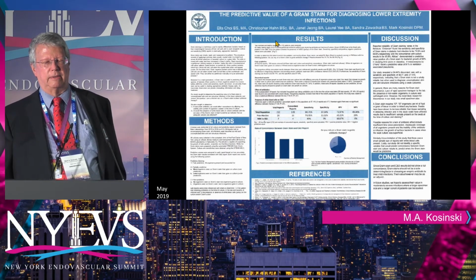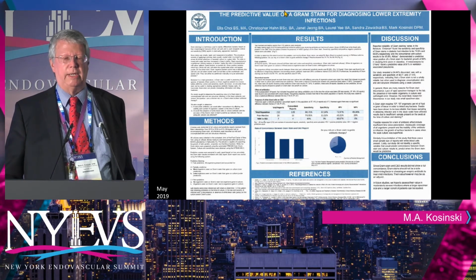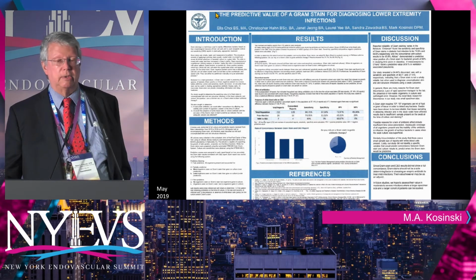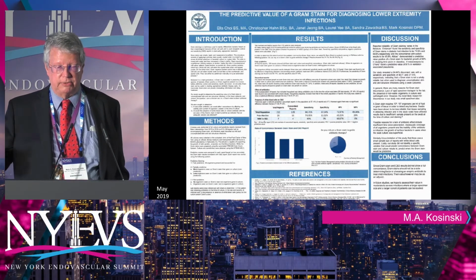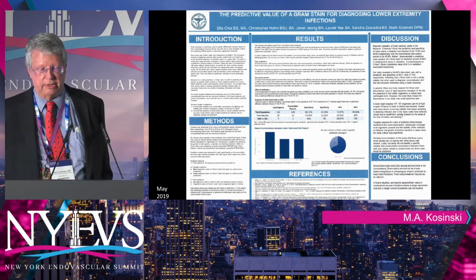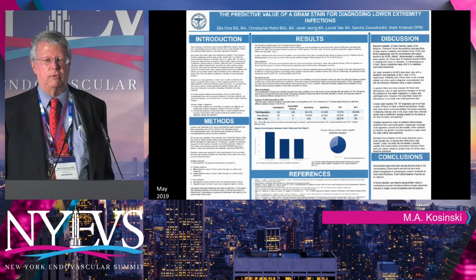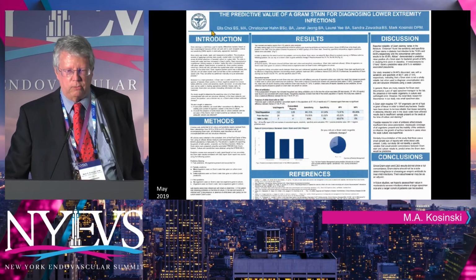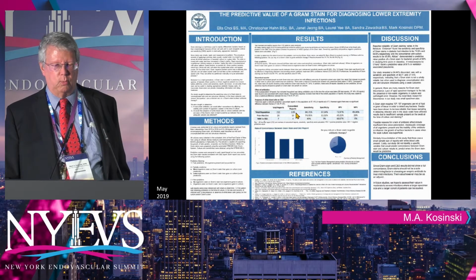This is a poster that I did with a bunch of students back in 2019, pre-pandemic. And we have a poster competition every year. We have for many years, and Scott Millay comes down and judges it. And this is one year where I thought this would be interesting. Let's see the predictive value of a Gram stain for diagnosing lower extremity infections. And we looked at the infections that we had seen at the New York College, FCNY.